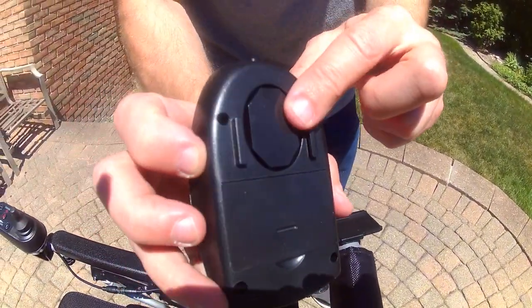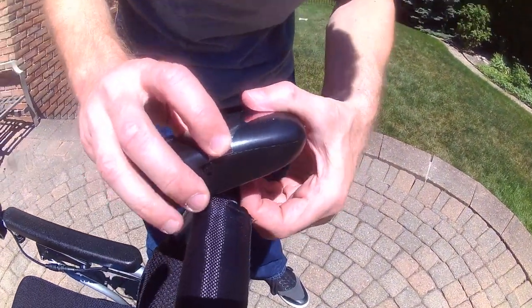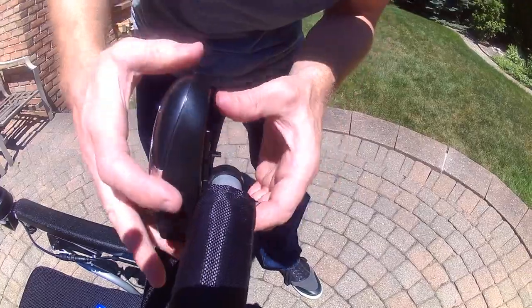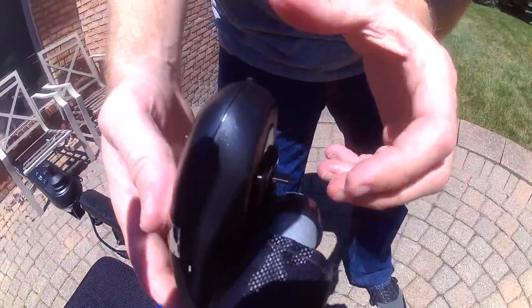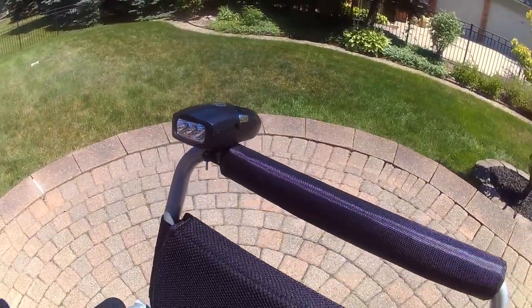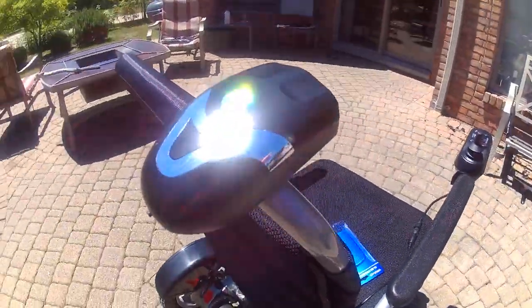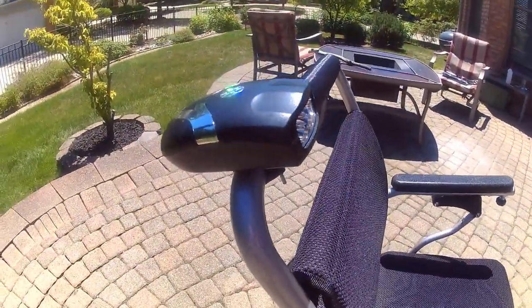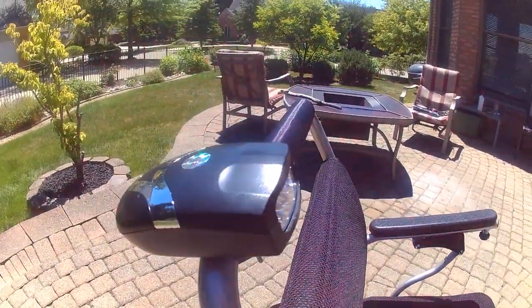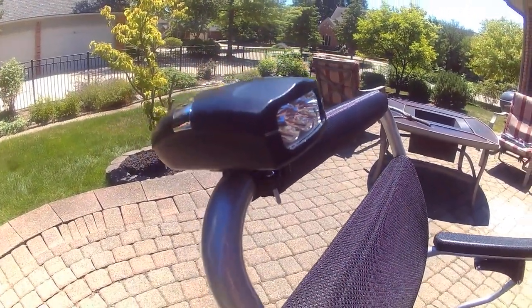There is a ridge on the bottom of the light, and I will simply slide the light on. And there you have it — the light on the back of the Eagle or AHXLS folding power wheelchair. Very simple, very easy.